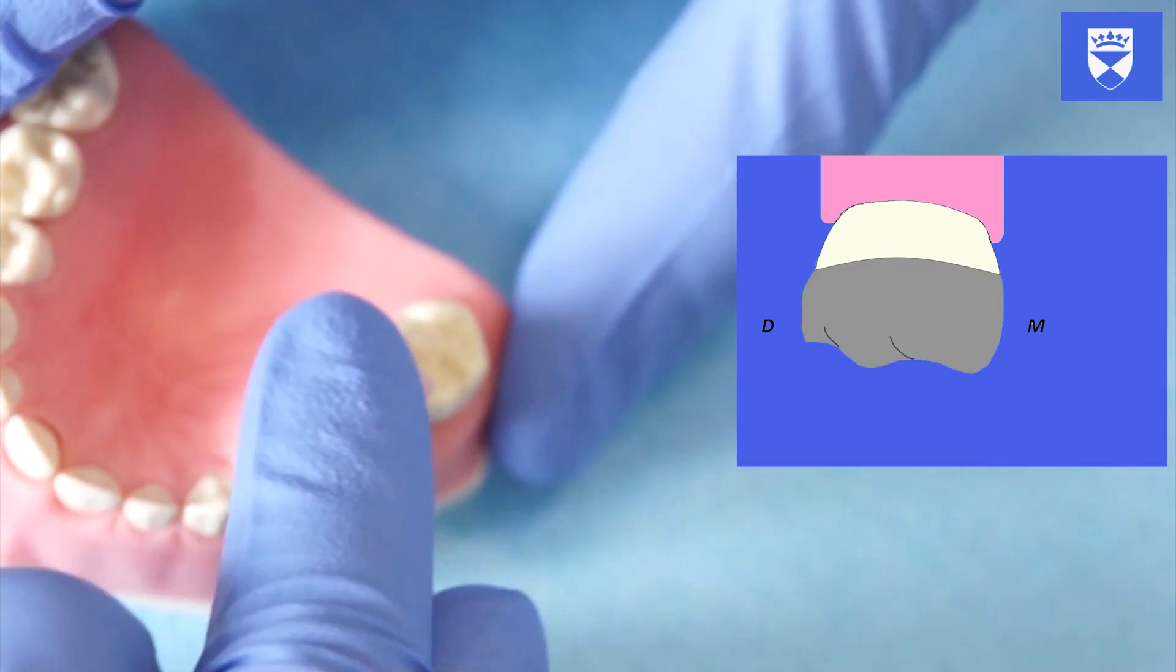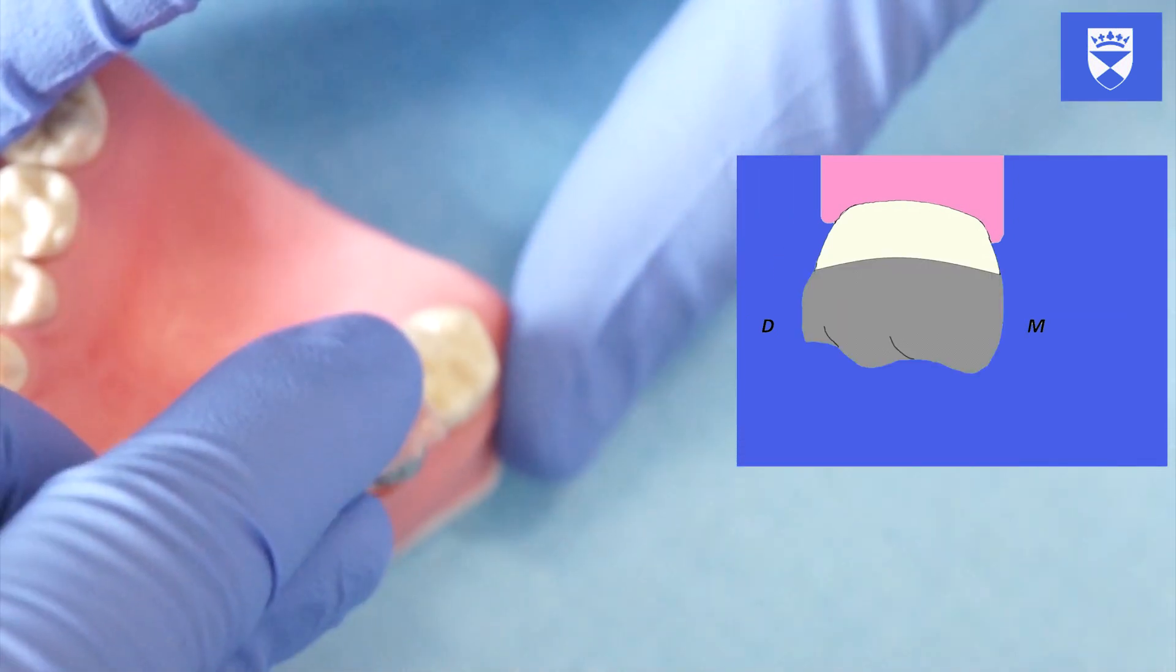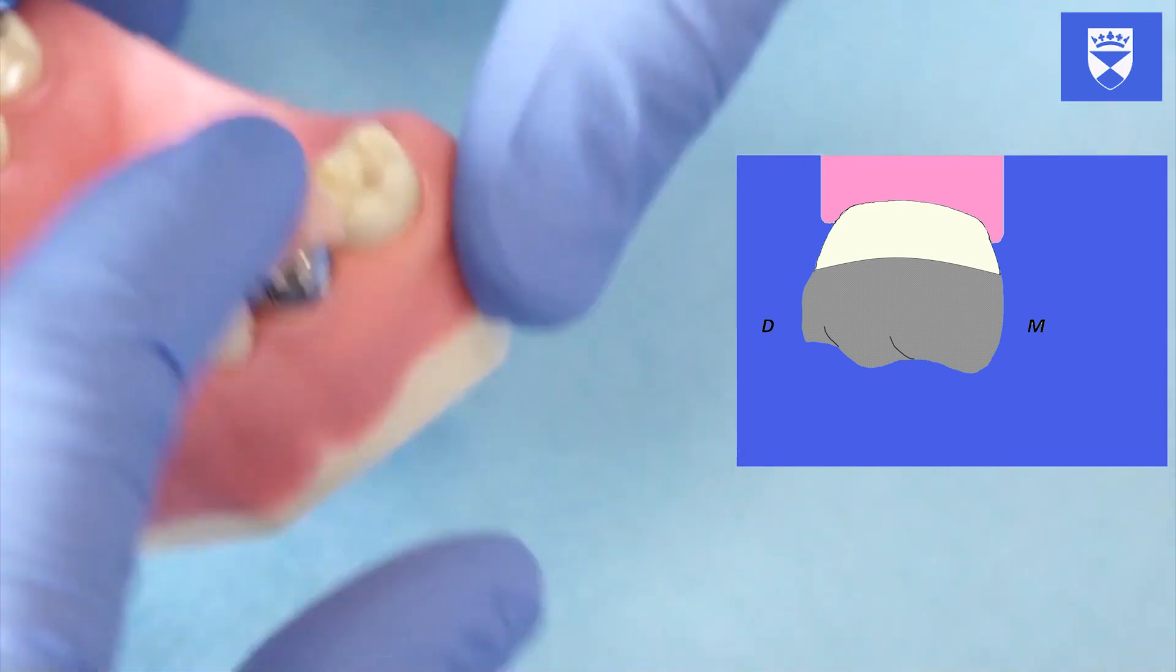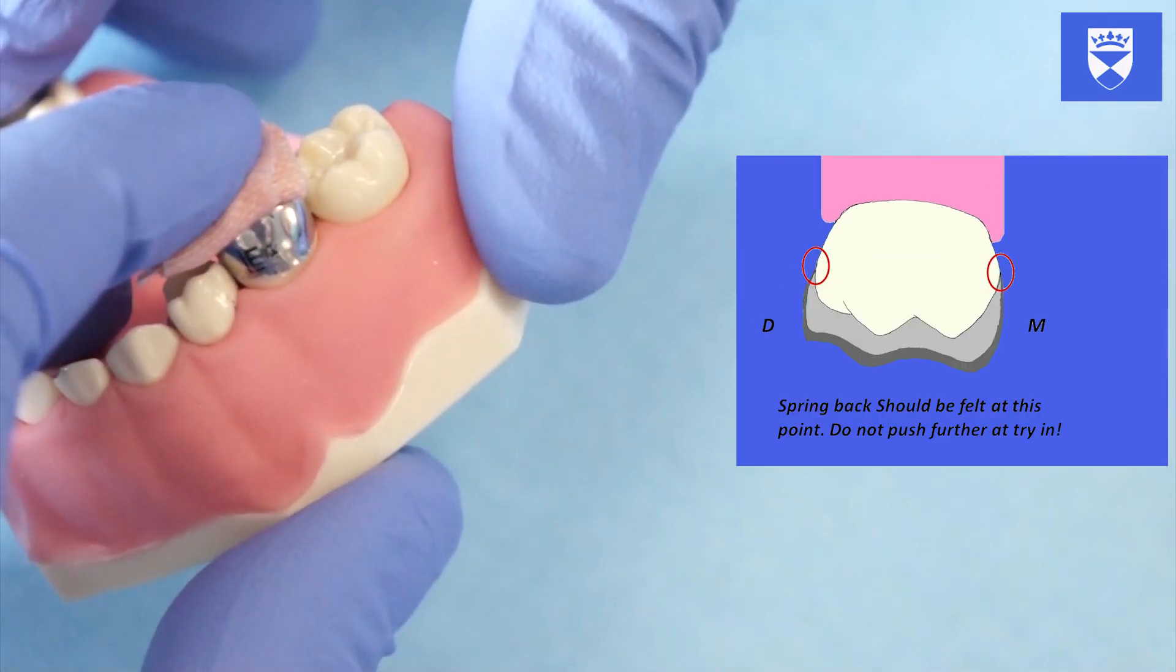The crown should be able to fit over the point of maximum convexity of the tooth with firm pressure. It is important when trying the crown on the tooth that you do not push the crown beyond this point. Apply enough pressure to observe spring back.